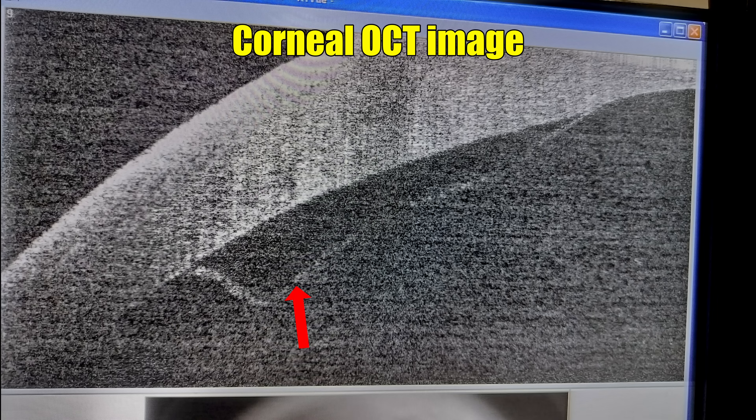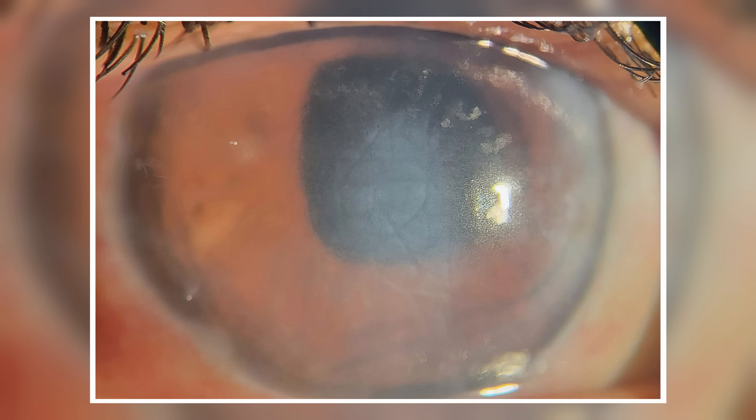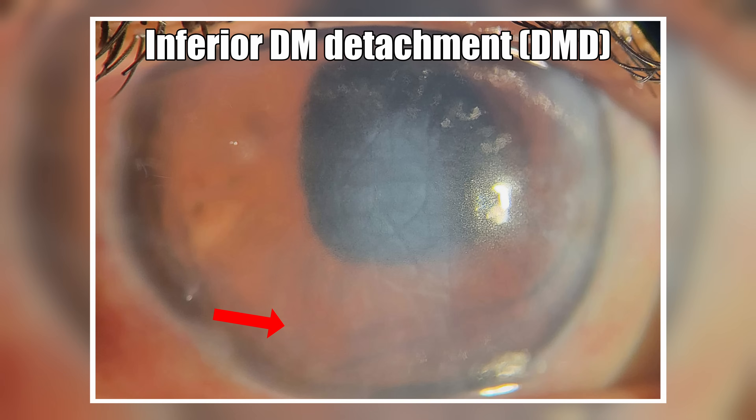The corneal OCT clearly shows a swollen cornea and a detached membrane in this area. Looking at the clinical picture, this is the area where it is detached, this is the edematous area, and unfortunately it's starting exactly from the center of the eye all the way down inferiorly. So we have an inferior Descemet's detachment and it's fairly large and quite long-standing.